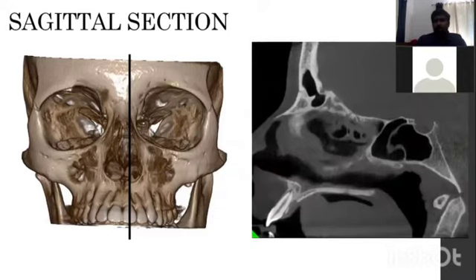Everything you can see. And we can compare it with anatomical structures nearby, like if there is a periapical cyst or any lesions, we can appreciate more, like the incisive canal or mandibular canal. And we can measure the length from the anatomical structure to the periapical region or to the tooth, like from the maxillary sinus, the incisive foramen, incisive canal, inferior alveolar nerve canal.